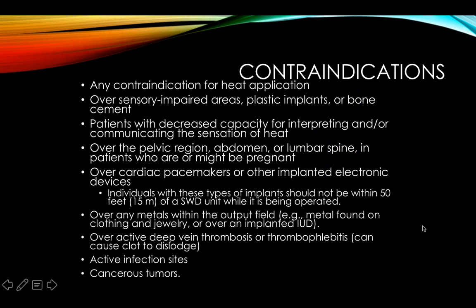Over any metal that might be within the output field, so that could be on clothing like buttons or zippers. So, yoga pants with zippers, you wouldn't want to have those on. You'd want absolutely no metal, no jewelry. Again, even an implanted IUD, an intrauterine device for birth control, could be a problem.